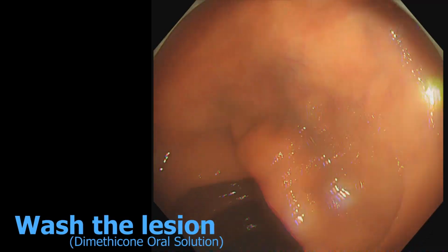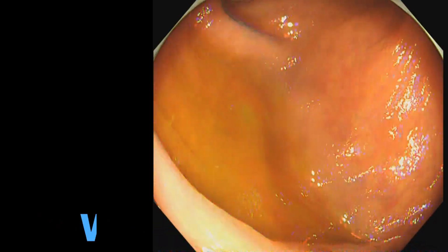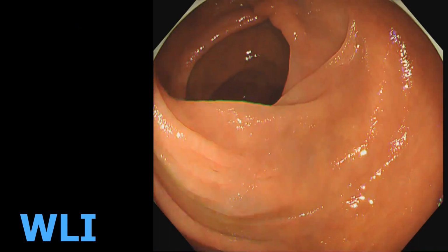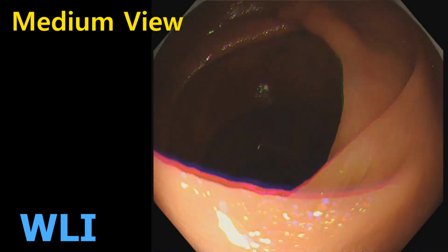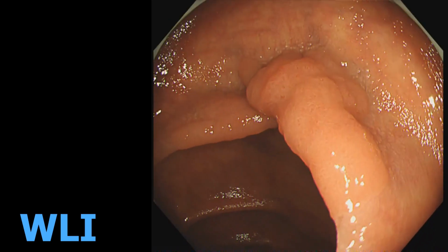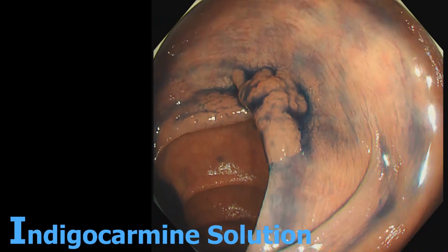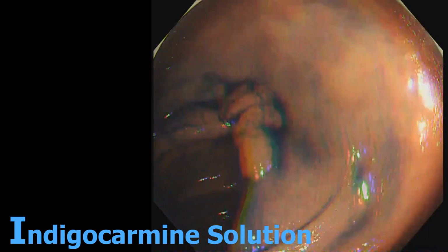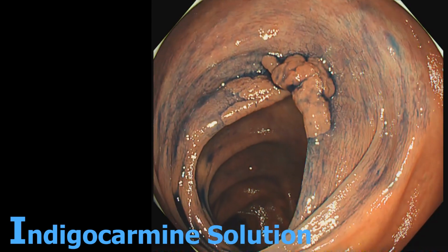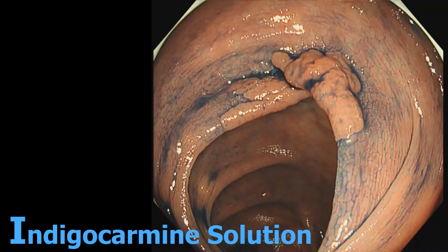First, wash and clean the region. Next, observe the region in the far view by white light imaging, median view, and close view. Stain the region by indigo carmine solution in the far view, median view, and close view. The region boundary is clear, and the extension of the region can be seen on the left side. NBI observation is performed after washing out the indigo carmine solution.